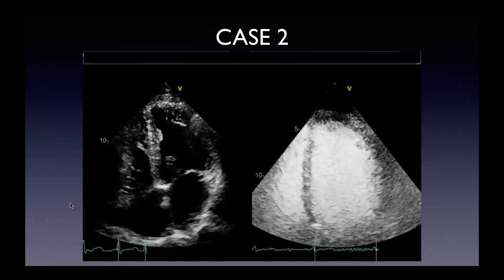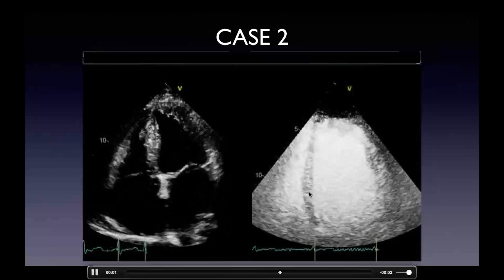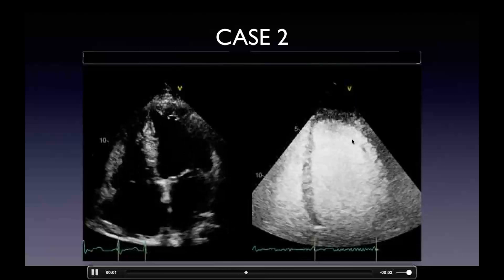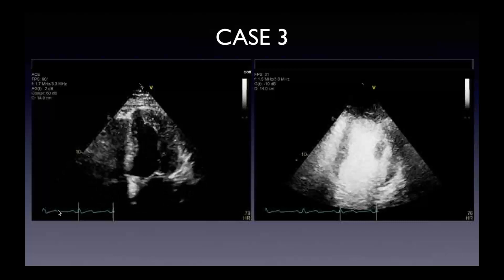Same case: apical four-chamber view without contrast versus with contrast. With contrast you can trace the endocardium all the way around. You can see the trabeculations in the background, which you don't trace — you trace behind the trabeculations at the true compacted myocardium.